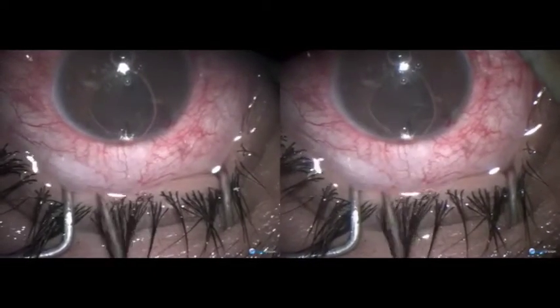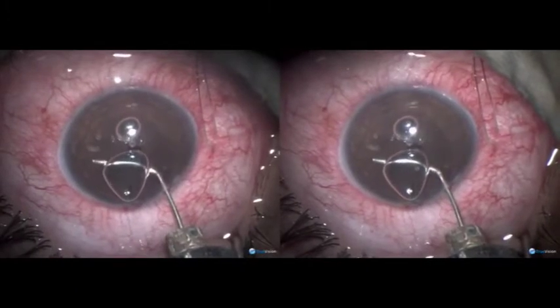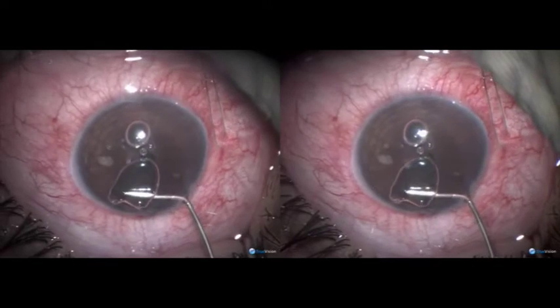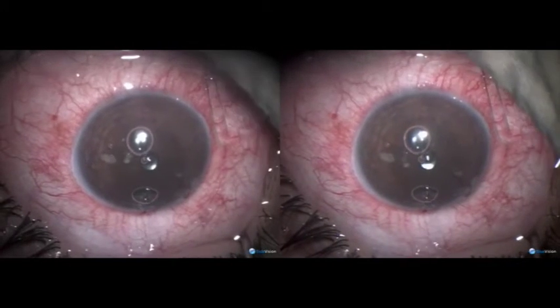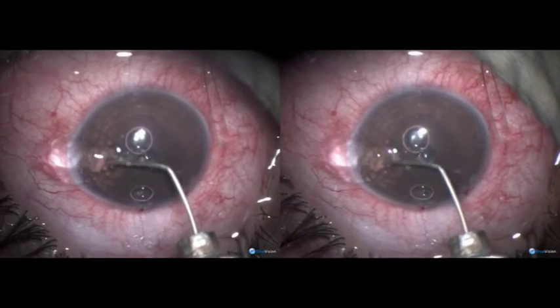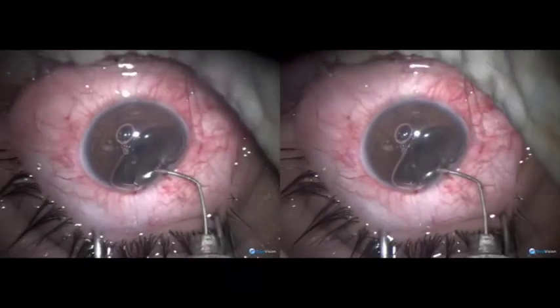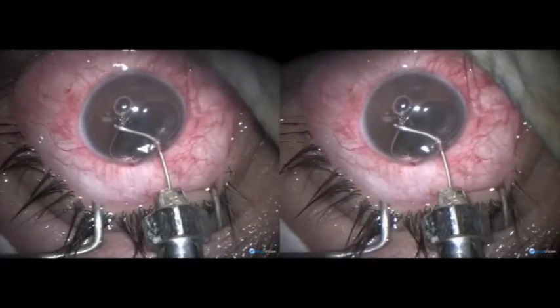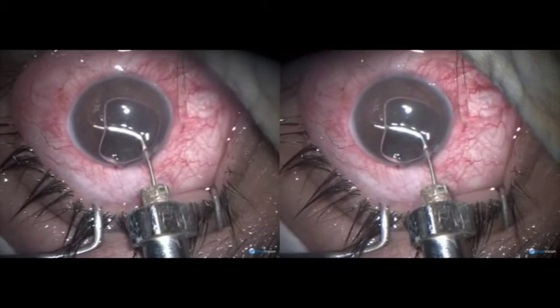There is still plenty of helon inside which we need to clear. So we take the cannula inside the anterior chamber and aspirate. Then here is helon from the anterior chamber. Put air in the anterior chamber — you still find helon which you can aspirate.